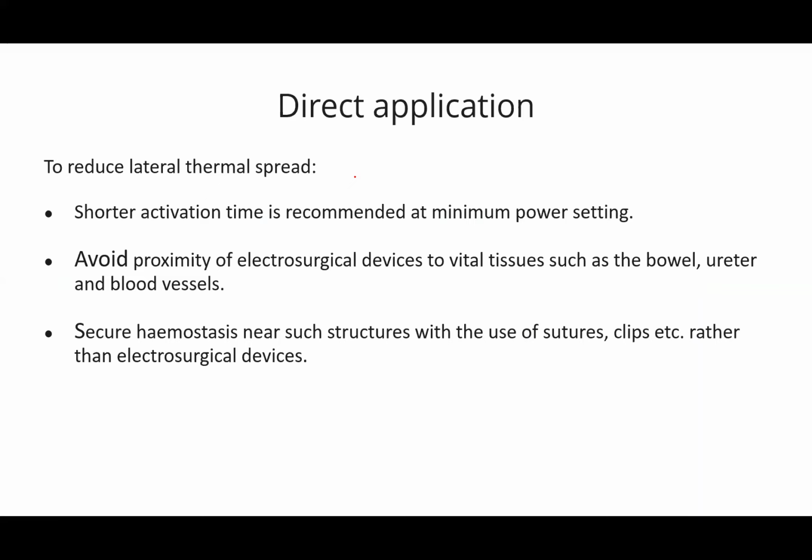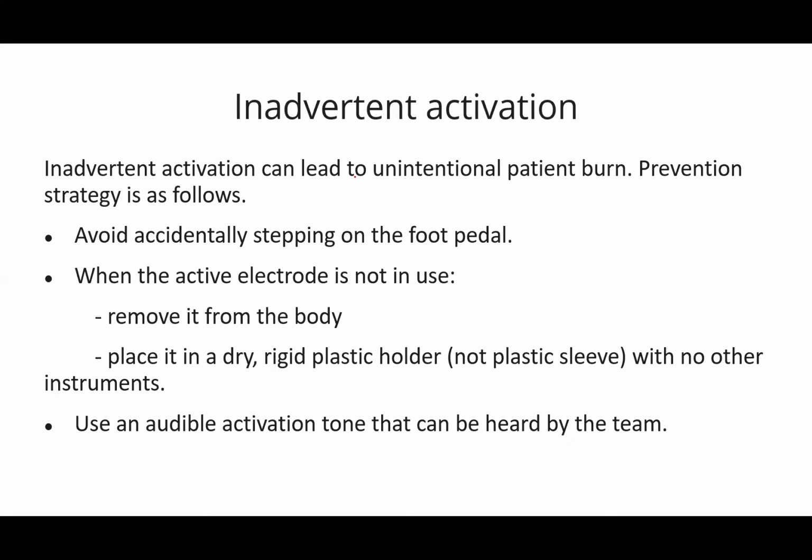To reduce lateral thermal spread, a shorter activation time is recommended at a minimum power output. Avoid proximity of the electrosurgical device to vital tissues such as bowel, ureters, or blood vessels. Secure hemostasis near such structures with the use of sutures or clips, rather than electrosurgical devices. You can have inadvertent activation.